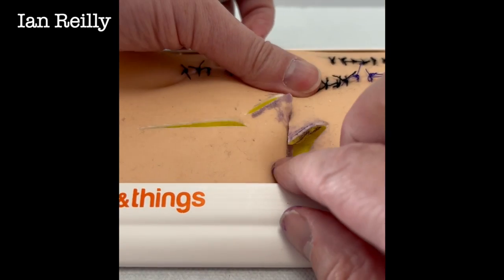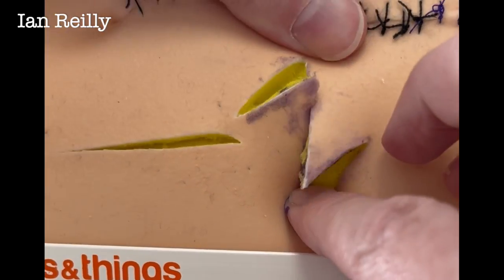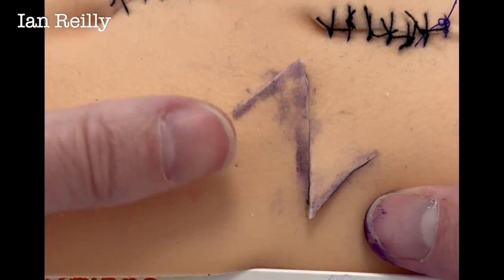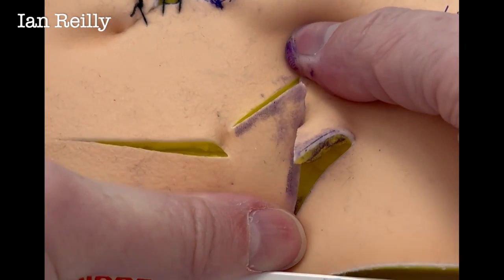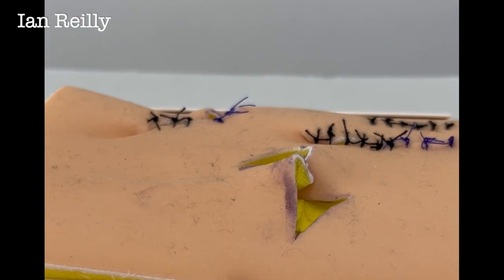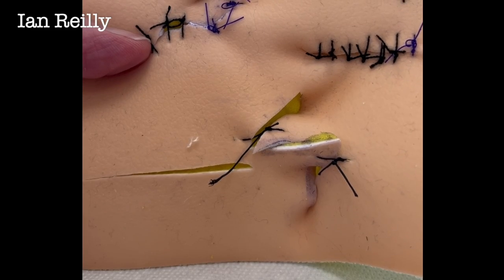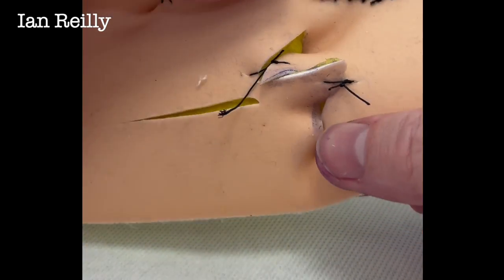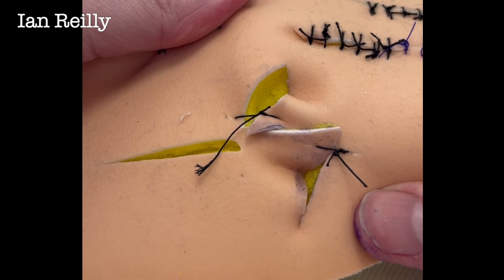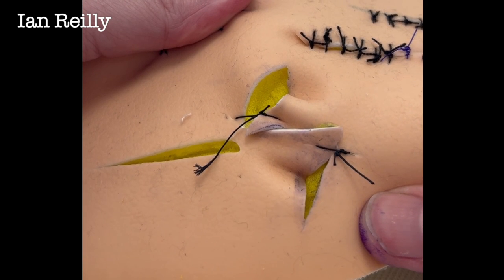As that contracts down, you can sort of see how it wants to move. That almost wants to go left and right — this is where you need a glamorous assistant. If you see that stretching down, you can see how it stretches across like that. I'll put a couple of stitches in to show the final result — I'm going to have purple fingers for the rest of the day. These pads don't really approximate real tissue, but you can see how they come together as those two legs cross over.